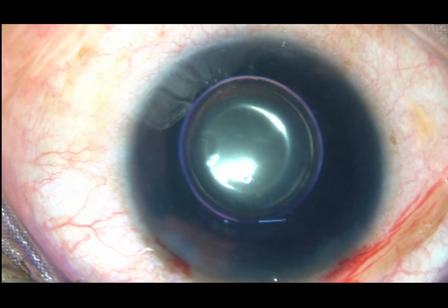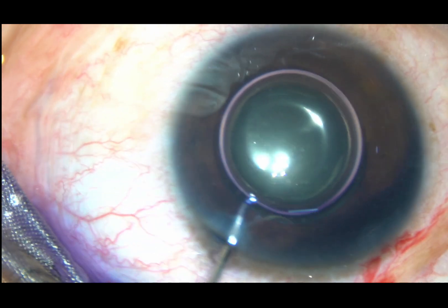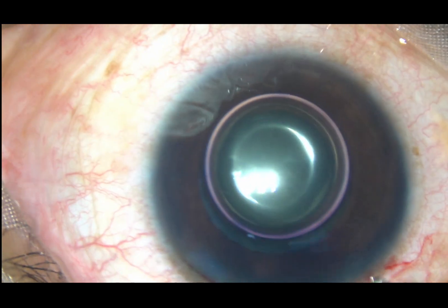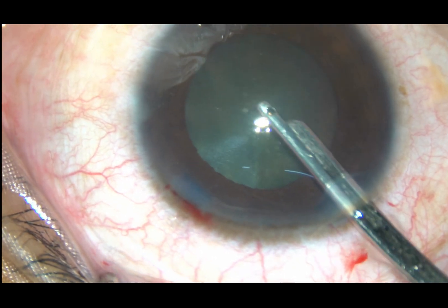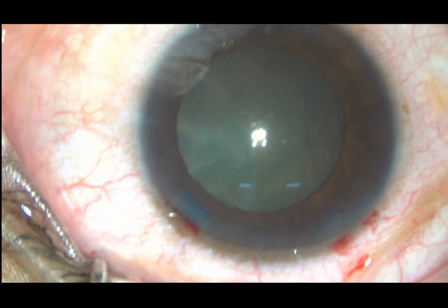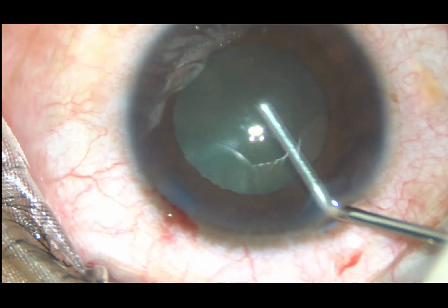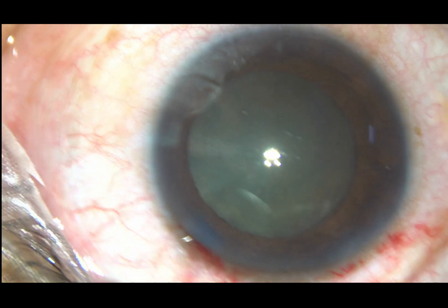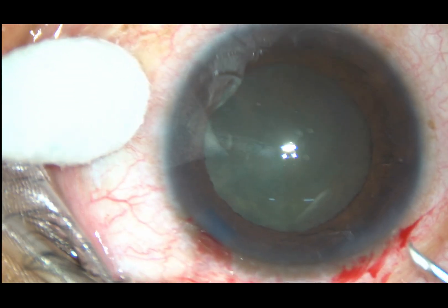Now adrenaline is being used in this case to see if the pupil dilates to some extent. The dye is washed out and I find that the adrenaline has worked to some extent — the pupil has dilated a bit. Now after injection of viscoelastic substance the pupil dilates to some more extent, and this is good enough for doing an adequate-sized capsulorhexis.